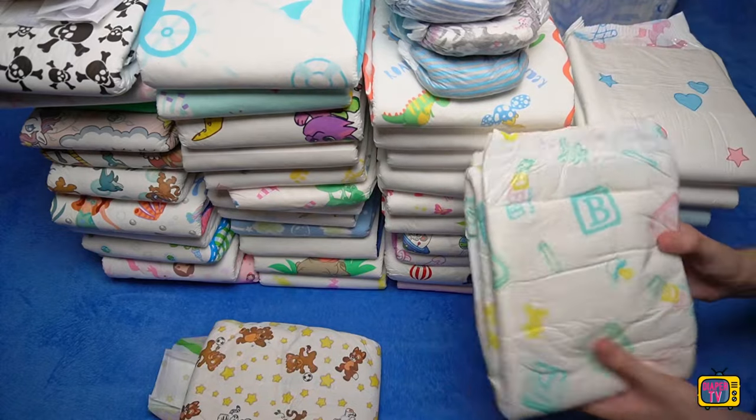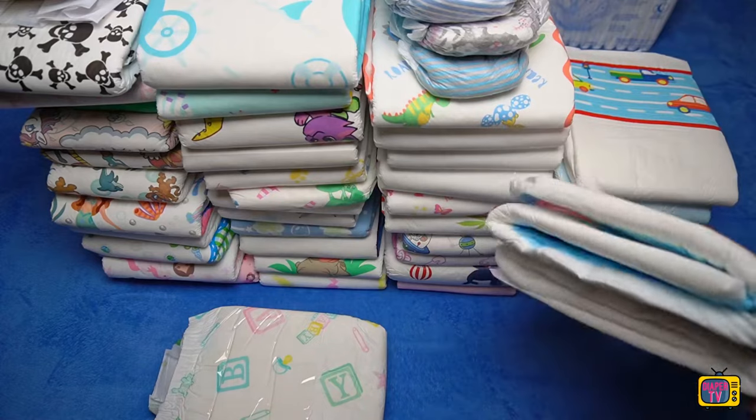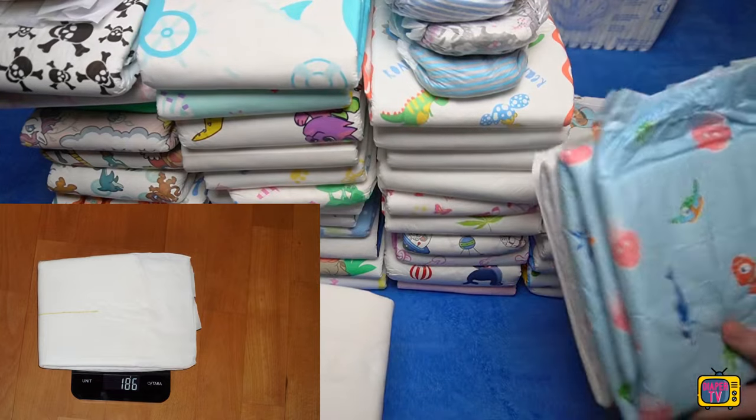The Supreme Briefs are pressed quite hard into the pack. You should fold and knead them a little lengthways so that they are less rigid and fit better. Empty, the diaper weighs 186 grams, making it one of the lightest I have tested so far.